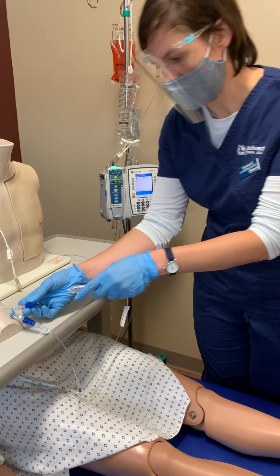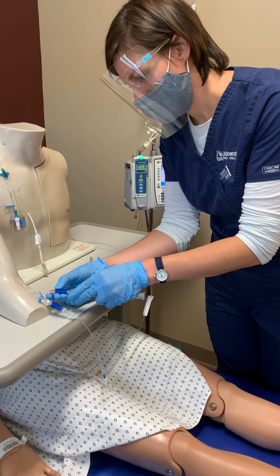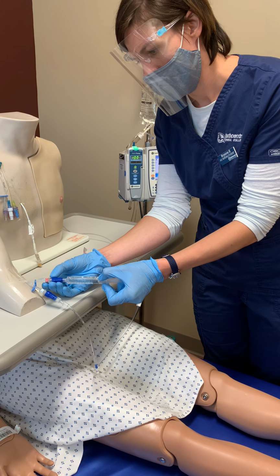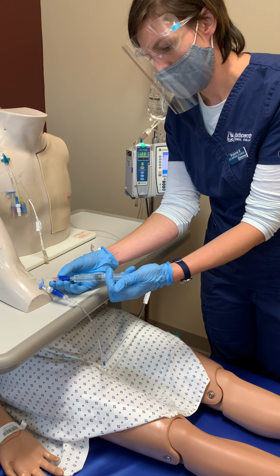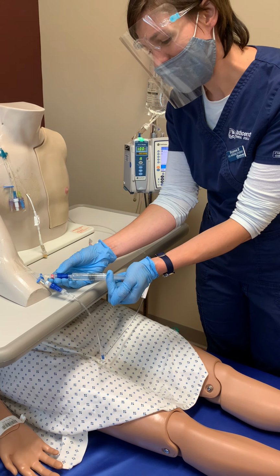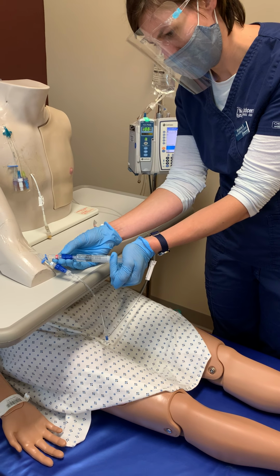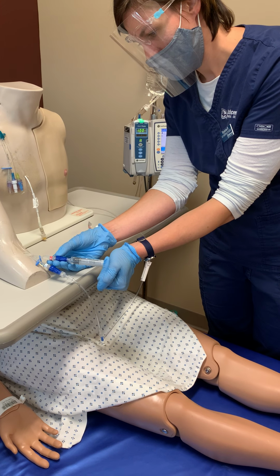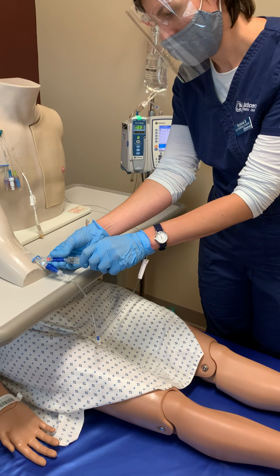I have sanitized this with the swab so I can do my first flush. And as previously stated, if this wasn't already in use, I would also be doing a site assessment. But I did that upon admission just a couple of minutes ago.